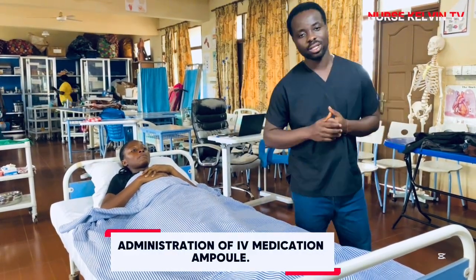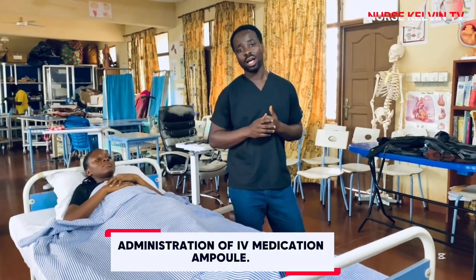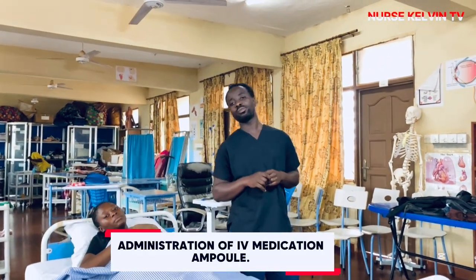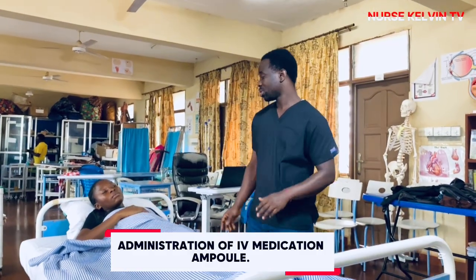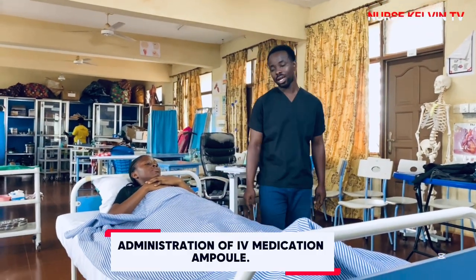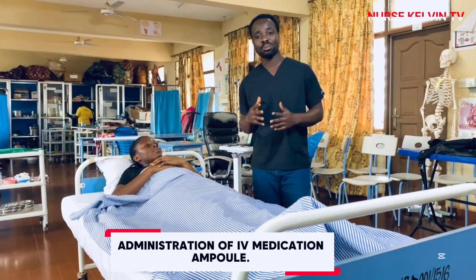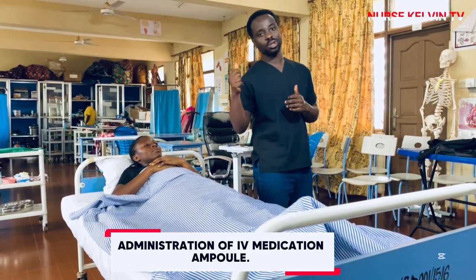My name is Nesty. Today we are going to learn about administration of IV medication, ampoule. So here is my patient, Mrs. Augustina. So guys, stay with us.